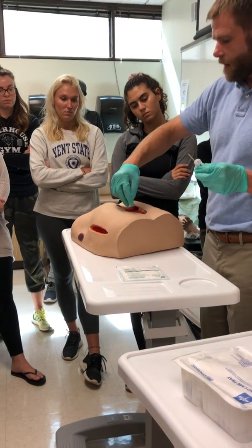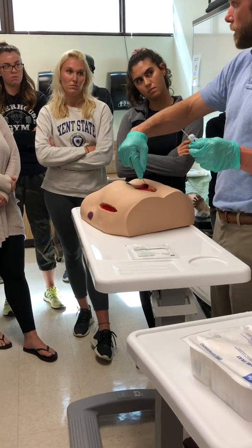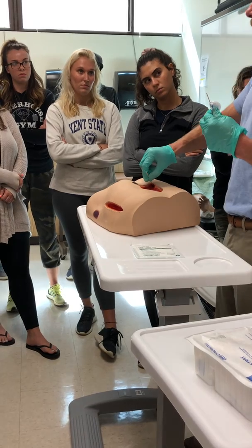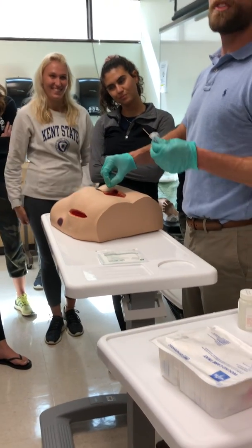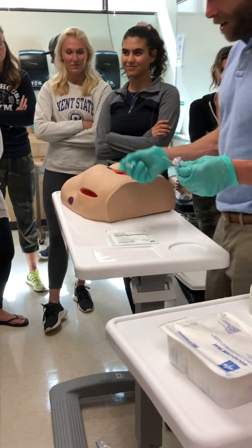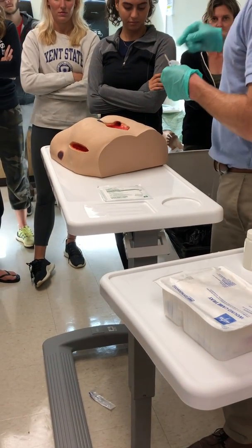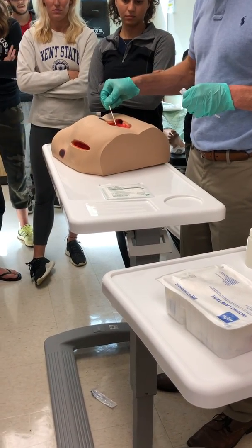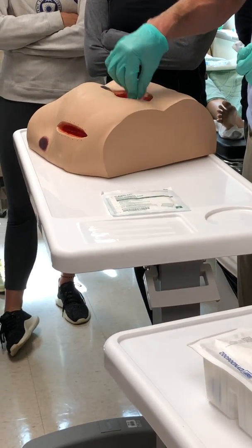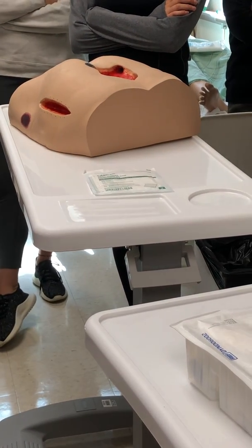So I'm going to go into the tunnel. Guys, I've lost a whole entire cotton tip applicator. I didn't lose it, I held onto it, but the whole thing went into a tunnel before. So don't be surprised when that happens. You've got to act normal. If you go, the patient's like, what's wrong? Nothing at all. I'm just like, oh, okay, cool. So the tunnel at 7 o'clock is 5 centimeters. The undermining. Why am I doing this? I'm trying to find the deepest spot. 2 centimeters. You guys good with that?